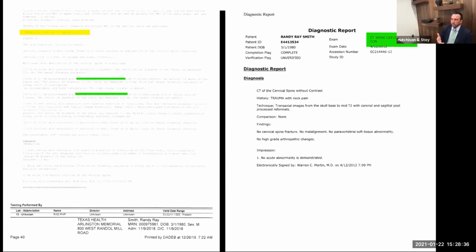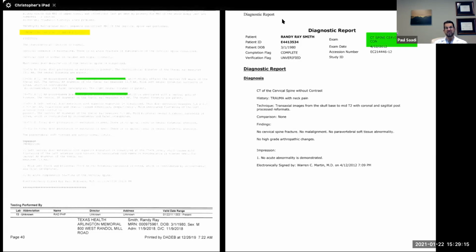And the herniation that we're talking about, is it one that would develop chronically over time, or is it more one that would most likely be caused by an acute traumatic event? Anything's possible, but 3 scenarios are that it just happened slowly over time, that it happened all at one time, or that there was a low-grade injury which was exacerbated. And by the look of the remainder of the neck, it appears to me most likely that it happened all at one time, or was a much more mild injury that got significantly worse all at one time. Right. Probably in the past, temporally related to when that first MRI, October of 2018, was done.